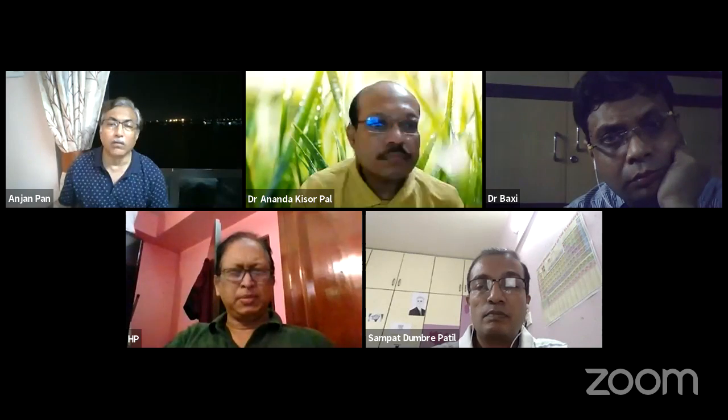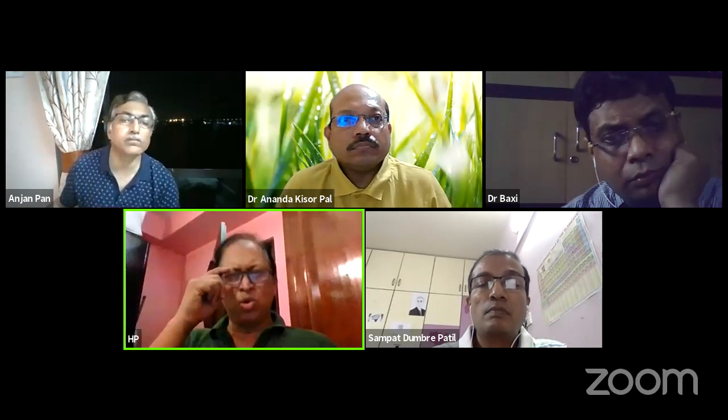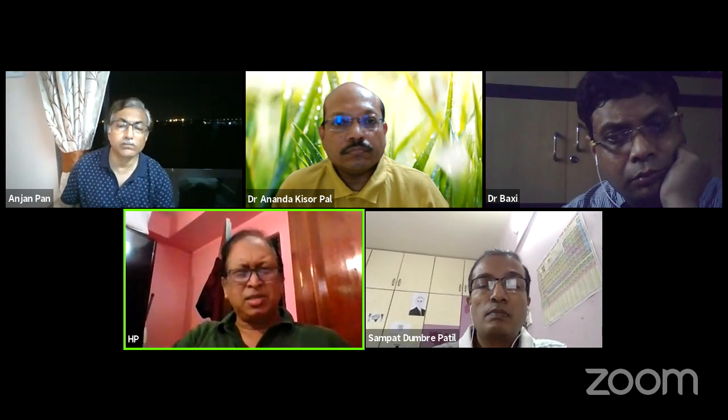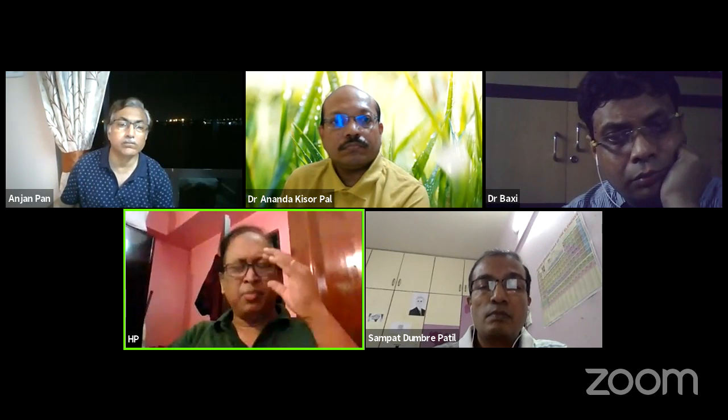Before going to Anjan sir, I'll ask Ujjwal sir, there was one case of yours where the sustentaculum part was not holding with a screw. It was lying independent. So do you think putting a screw through this and holding the sustentaculum part would have given you better fixation? It would have been better, but I was holding that with a K-wire. When I missed that, I didn't want to do any more damage because it's a one-go affair. You cannot do it 2-3 times trying to put the pins in, and it becomes a mess in a calcaneal fracture. So I left it alone at that point of time, and I concentrated and focused on the articular surface. So that was my prime goal.